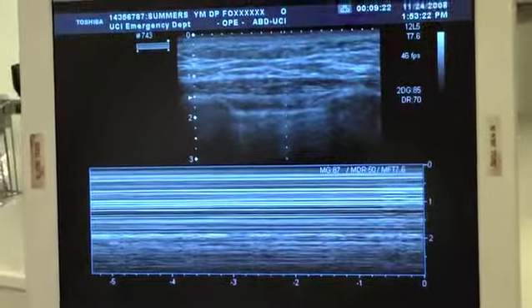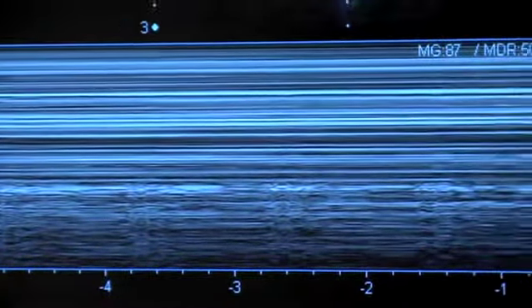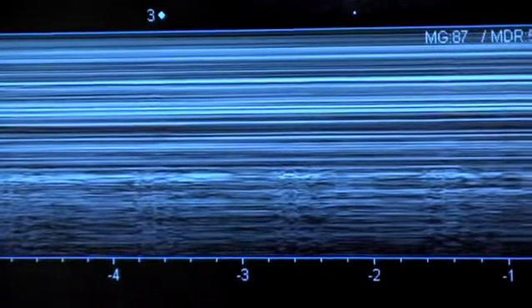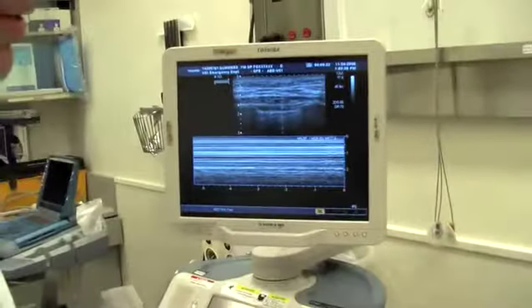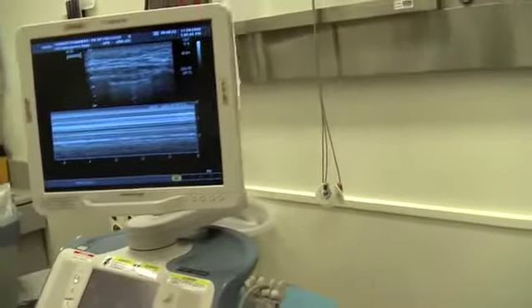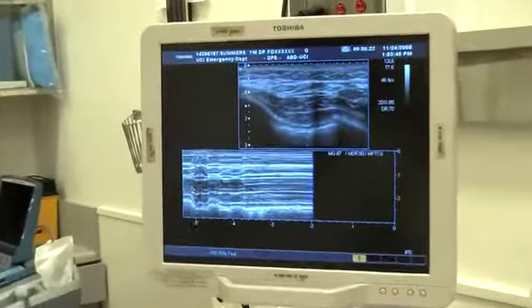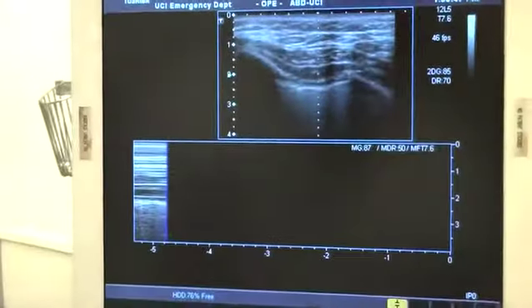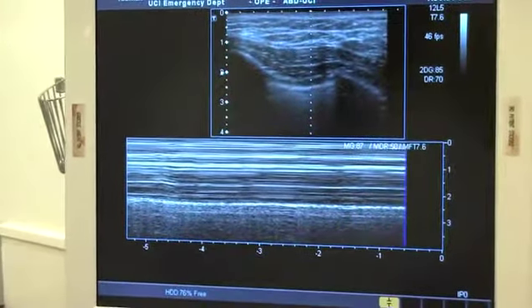So see how the screen is almost uniformly frozen. There's no shaggy, wavy, sandy beach at the bottom there in the far field. So we'll go back and show you what a normal M mode looks like. Nice beach. All right, that's it.